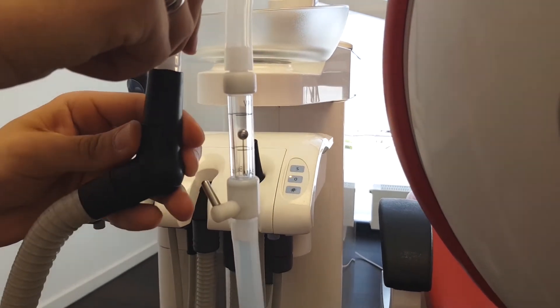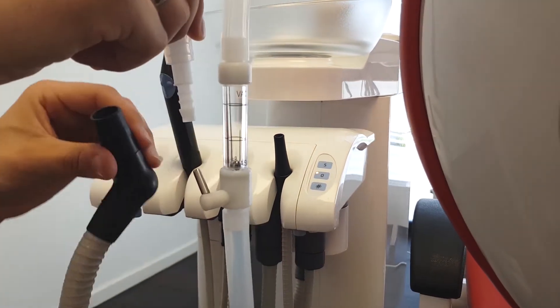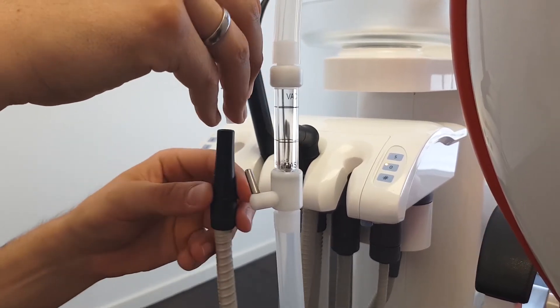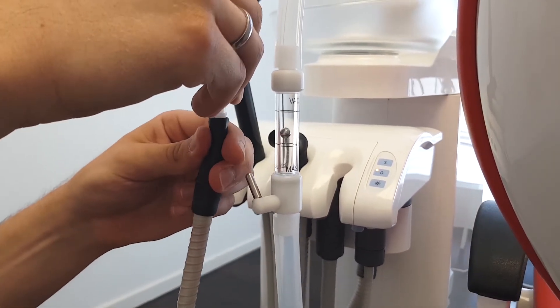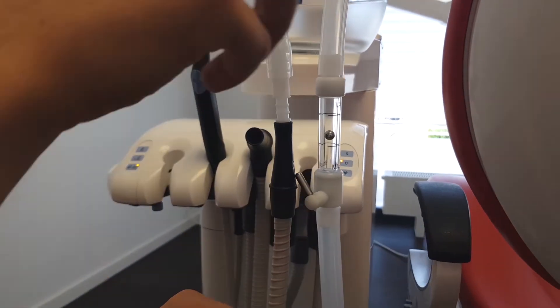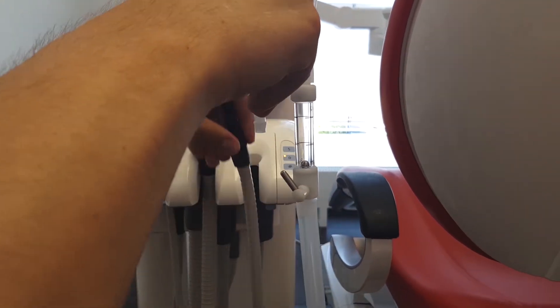Our vacuum control block can be connected to the high-volume evacuator and also on the saliva ejector. If needed, our adapter works on both sides of evacuators to make a good sealed connection to the system.